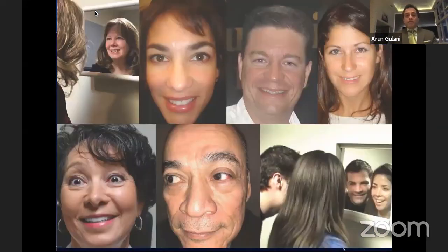Now, these are day one patients, all of them different ages, sex, from all over the world. And this is the appearance you want. Their eyes need to be absolutely sparkling white, painless, smiling before they fly out. So again, please focus on the slide. I want you to look at or imagine this outcome even before you start your surgery.